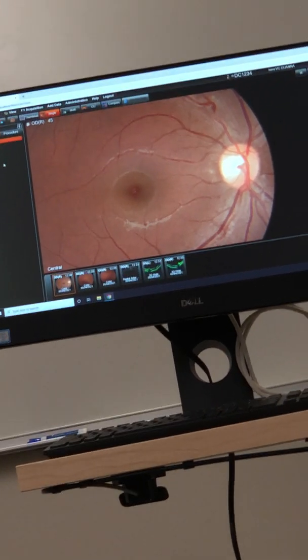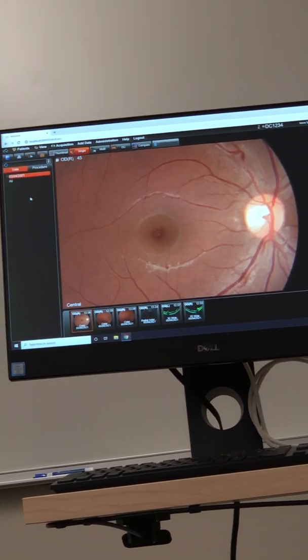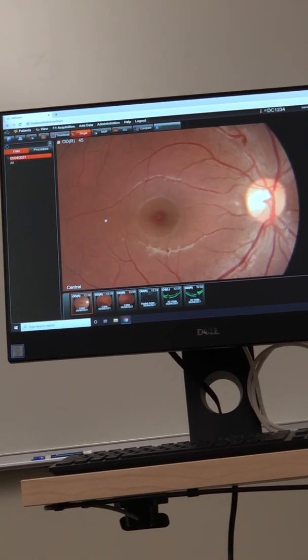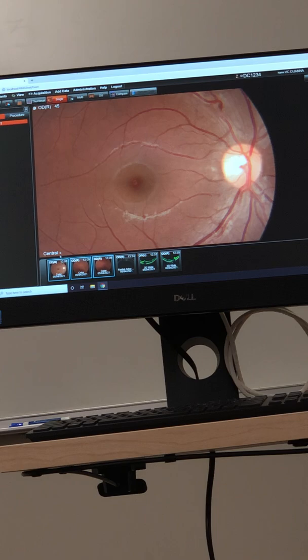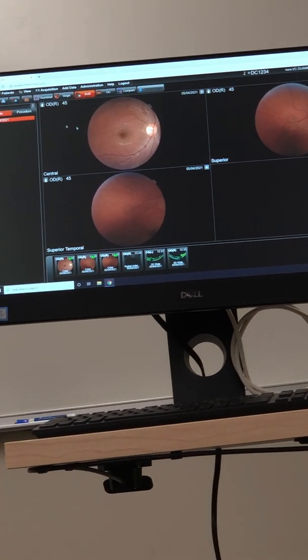So you could pull the first record up, then the last record up, and anything in between too, all on one page. Right. Yeah, like this, for instance. You can show them just like this.